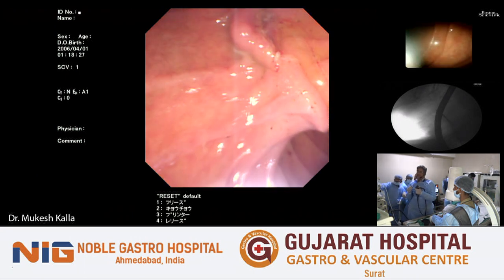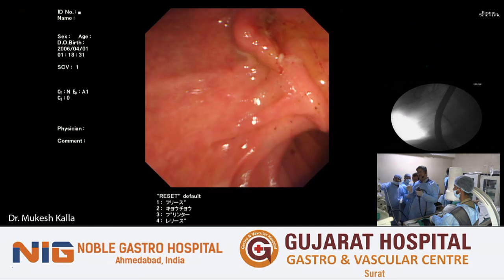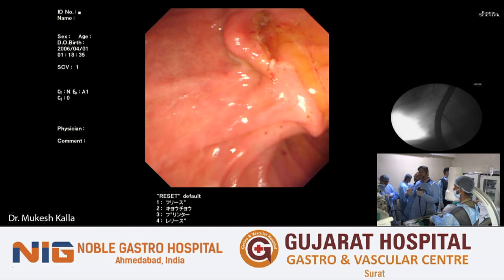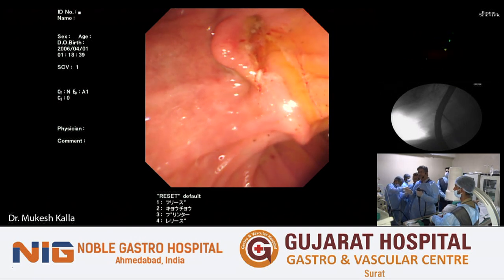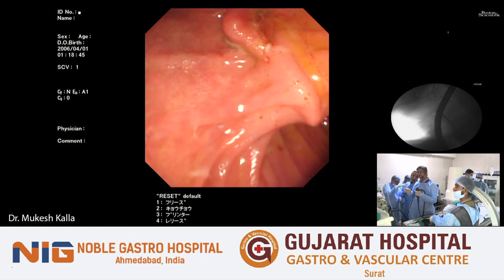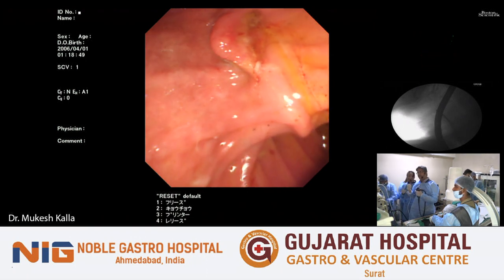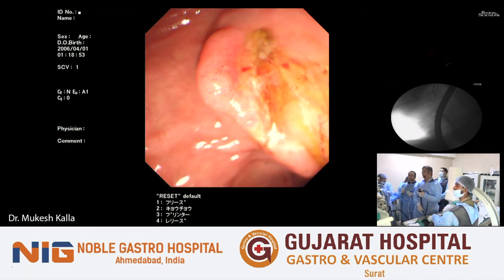Yeah, we are publishing a study where we are insisting that balloon sphincteroplasty for a cholangioscopy patient is mandatory for three good reasons. One is you need to save the scope, which is very important for us. The retrieval of the fragmented stones becomes very easy. And the third thing is that with multiple passages in and out, there won't be any struggle at the ampulla. Isko theek karo.